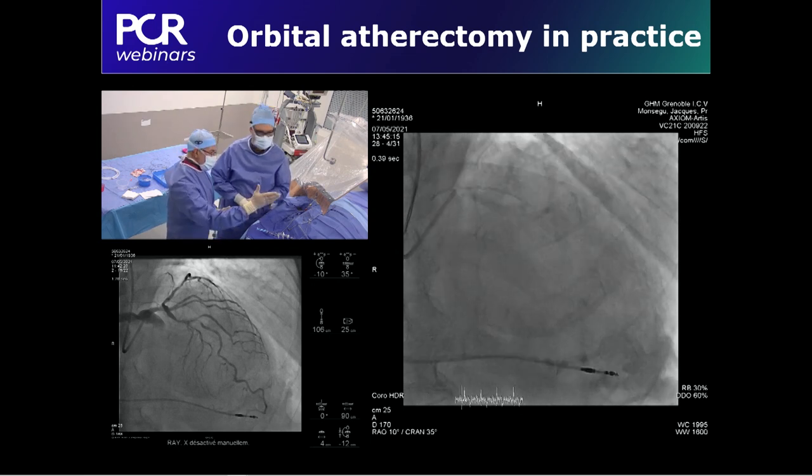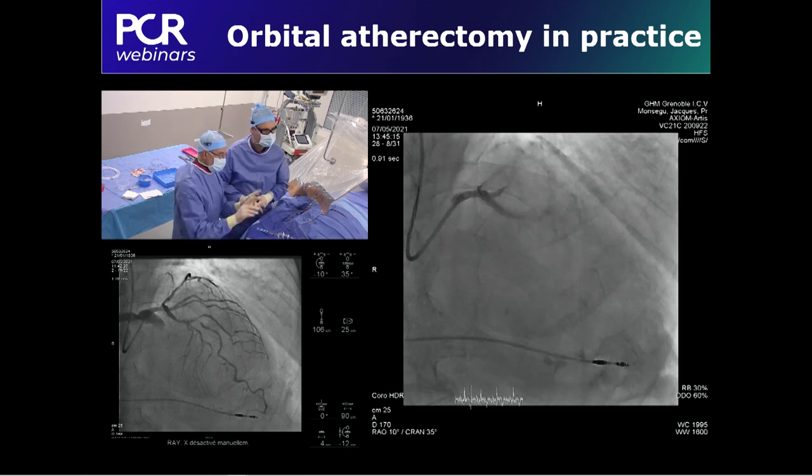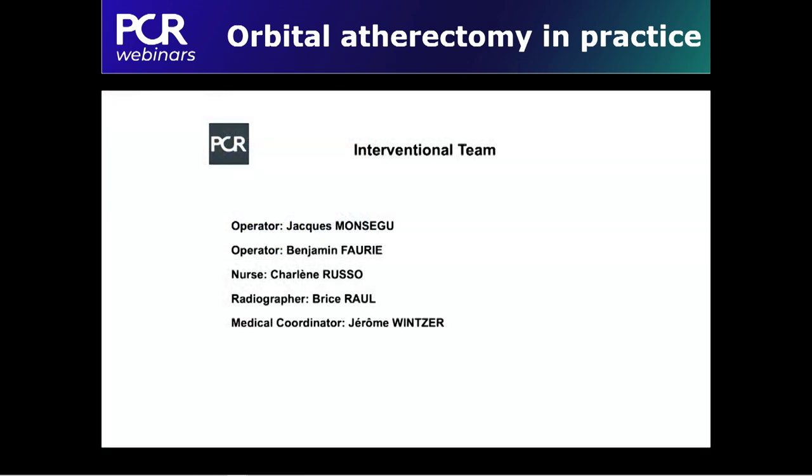Okay, thank you. And the final angio result is really perfect, with TIMI 3 free flow on both branches. So thank you, Benjamin. Case, Jacques, and really, really educational in many aspects. Now, I can tell you that it has triggered a lot of interest among the colleagues. We have lots of questions, so I'm going to ask you to be snappy and concise so we can address as many as possible.